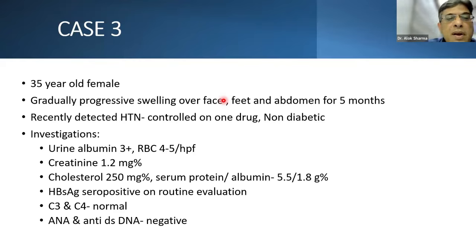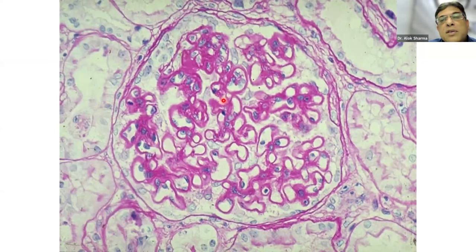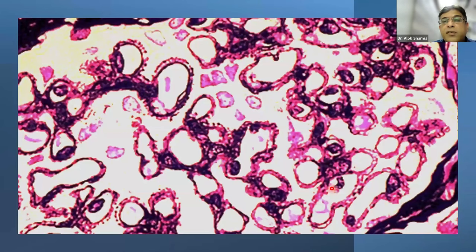This is also a similar case. It's nephrotic syndrome. But what has happened here is, if you had looked at the biopsy, you would see that instead of normal thin GBMs, GBMs were quite thick, right? And I think I had also given a slide of silver stain there. This is a snapshot from one of those slides. You can see that there are a lot of abnormalities in the GBMs. You can see these spikes, mottling, and all that. Meaning there is something getting deposited in the glomeruli, which is leading to that particular morphological pattern.